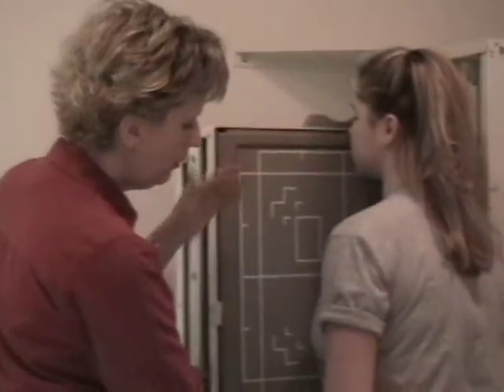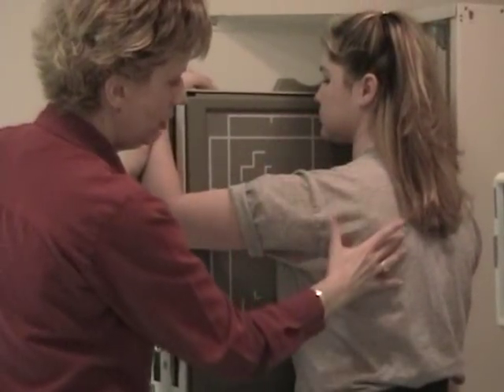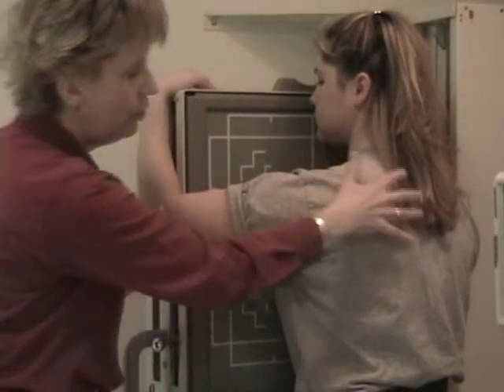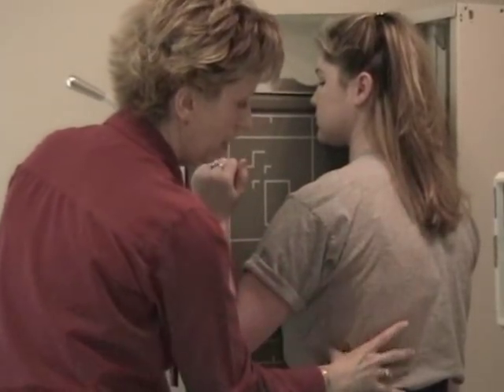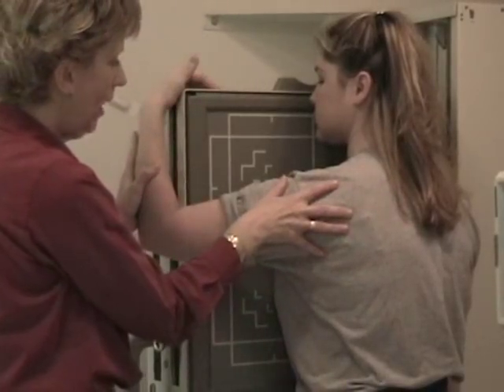The last thing we want to do is bring the arm up. We didn't change the position of the patient, but we're actually bringing the scapula out to the side, because if the arm is down, the scapula could actually be resting over the sternum. So we bring the arm out to the side. That pulls the scapula out of the way.